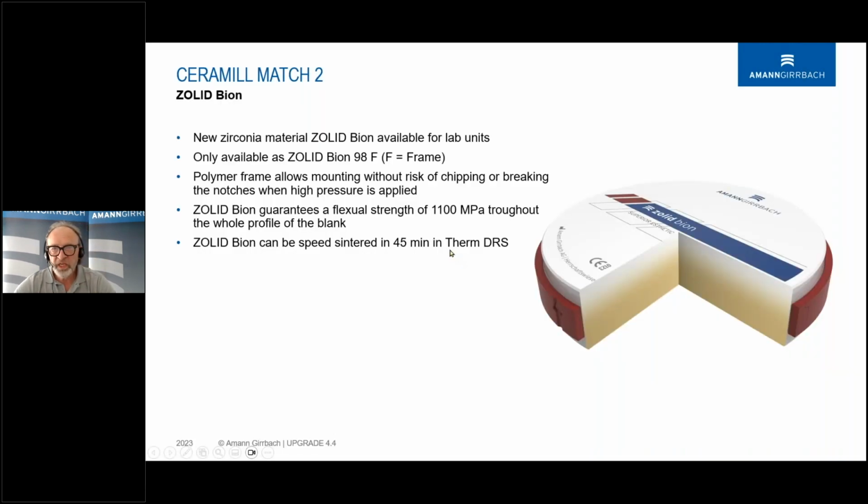What we can achieve here is the same strength over the whole profile, around about 1100 megapascal, and this allows us full arch bridges. The second thing is we have a new layering concept, with a very translucent part for the incisal area. So this looks more or less like FX, but the stability is more or less like Gen X. So the combination is outstanding here.